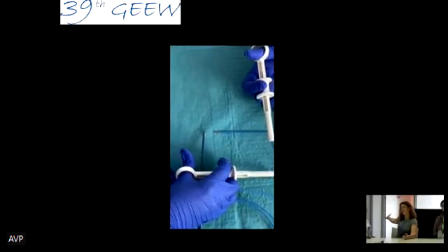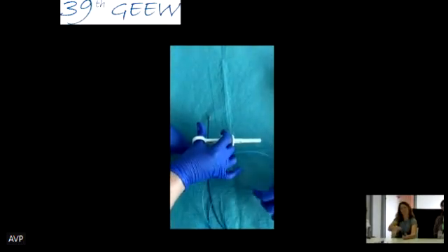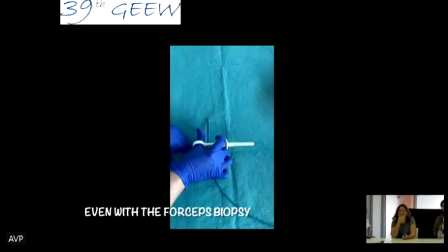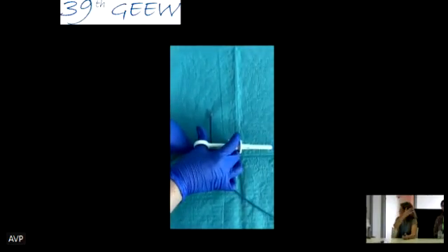This is something that not everybody knows, but when a doctor does the biopsy, forceps, it doesn't work, because you know that you have to take out the loops. And we can see very well here that there's a different transmission of forces. This is also important for the snares and all these devices.